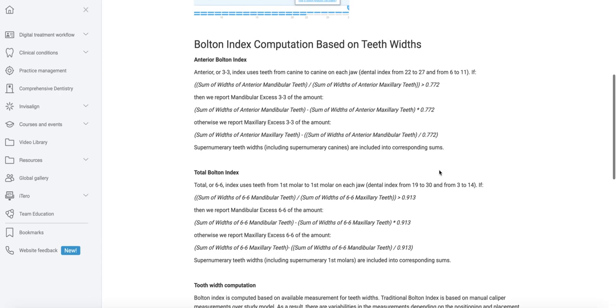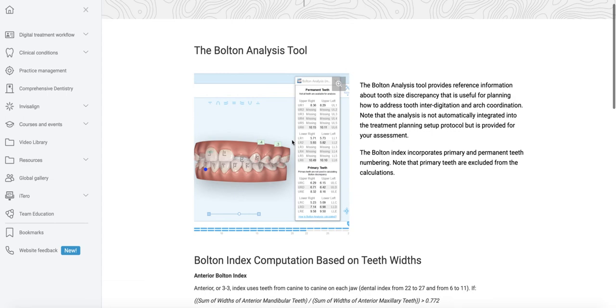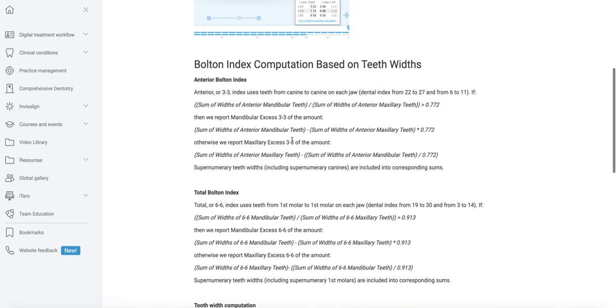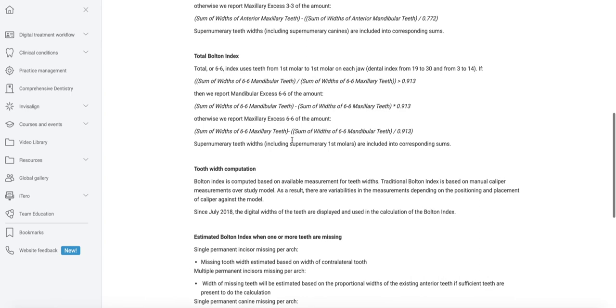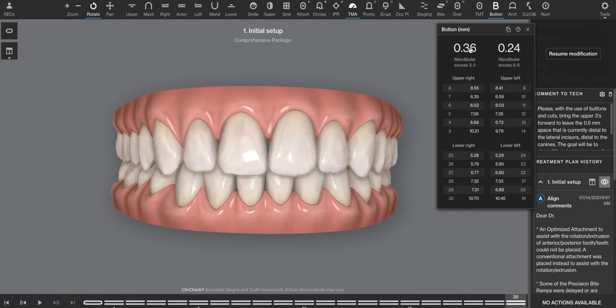Unfortunately, Invisalign does a pretty poor job of explaining how to use this information. You can go to their website and look at the description for the Bolton analysis tool. Either I'm not intelligent or this is way more complicated than it needs to be. Nowhere in here does it explicitly say that the distance or the space distance that is reported is the distance that is away from that 77%.